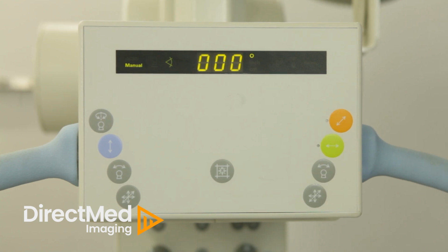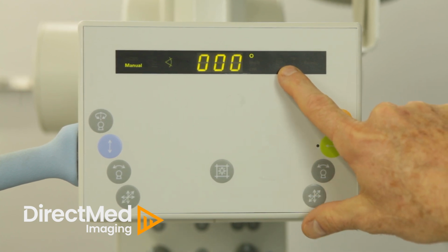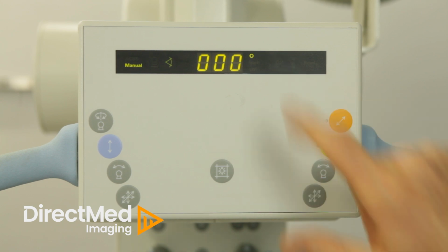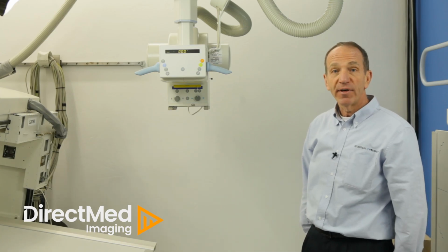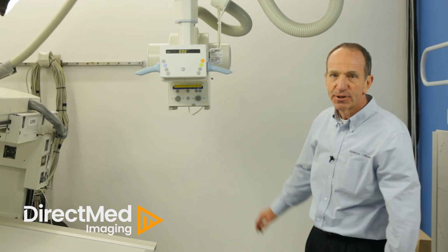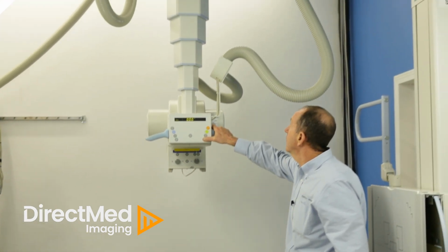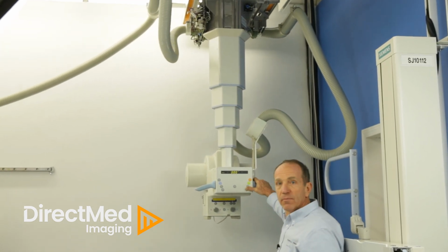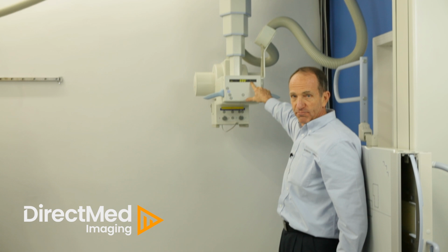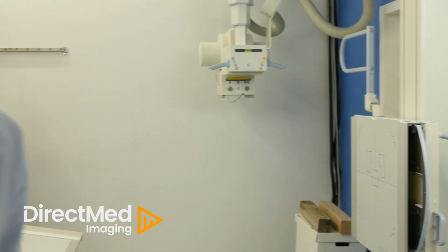If the overhead tube is in the park position, you should see a P illuminated right here on the overhead tube assembly. The reason there's no P in the display is because the overhead tube is not in the park position. Now, it's in the park position, and your table will move to 90 degrees.